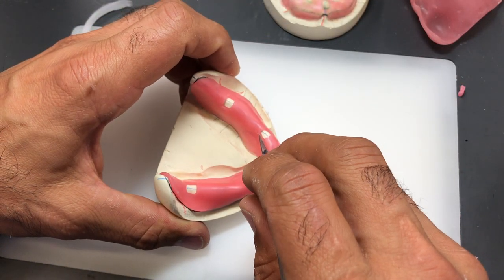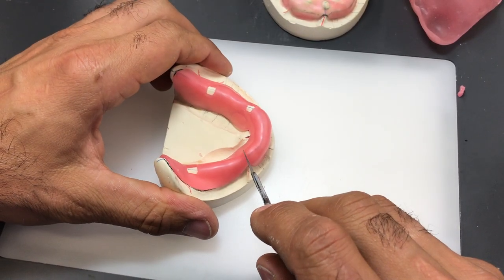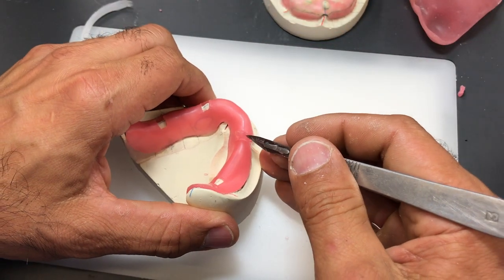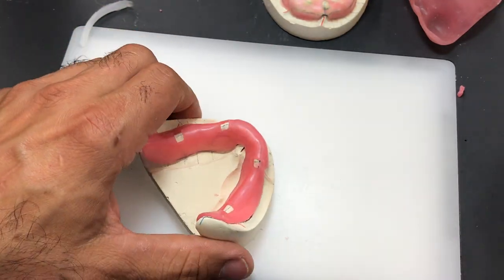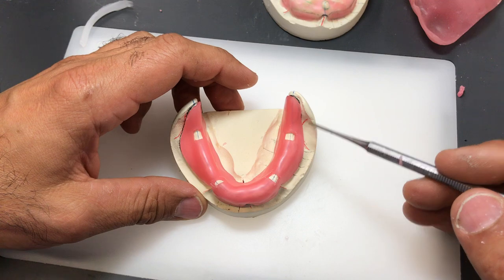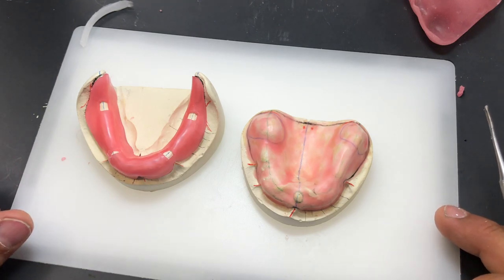Make sure you make your tissue stops broad enough, because if they're not wide enough, you're going to create a pressure point when you're working with a patient, and it's not going to be very comfortable for them. So make sure you create a bigger footprint, so to speak, almost like a snowshoe effect, so it's a little more comfortable for the client, and it reorients the custom tray back in the same position every time you do a border molding section as you're working around the tray. So this same technique could certainly be used for the upper as well, no different.